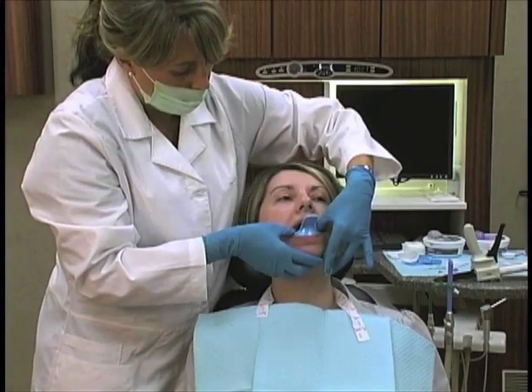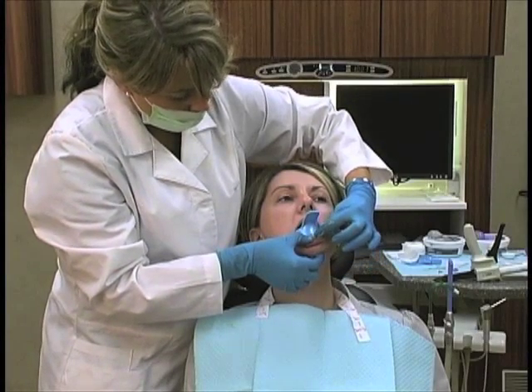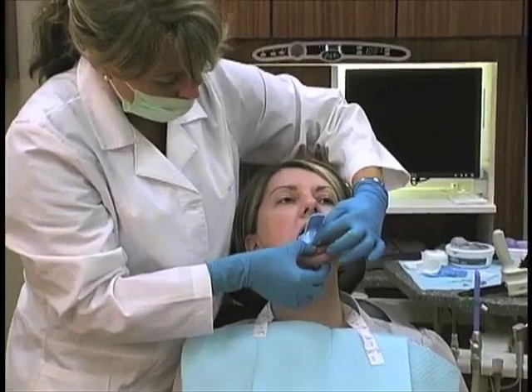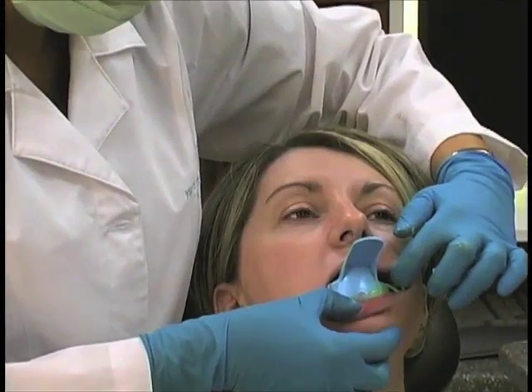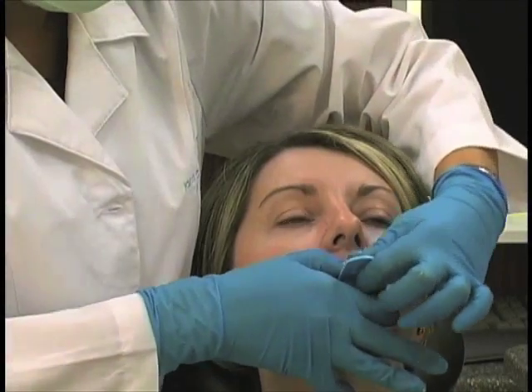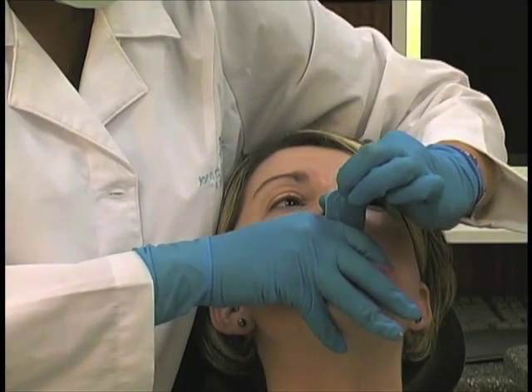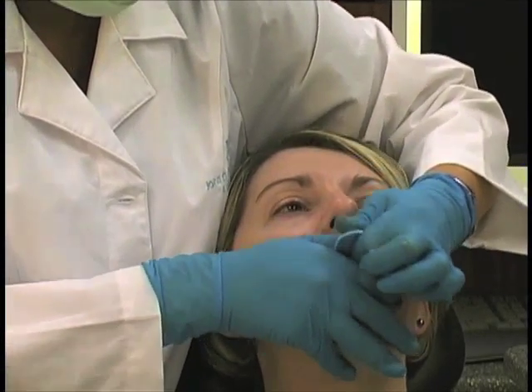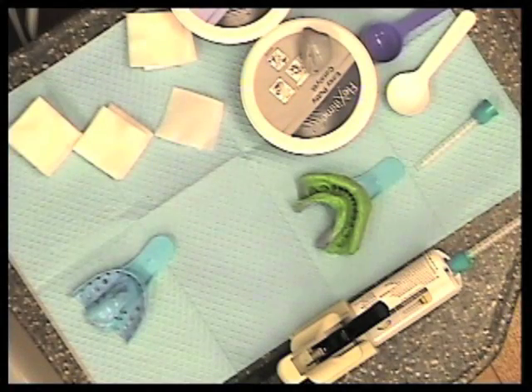Okay, what we're going to see with this material is that the wash material actually will set up first. Set time is about 2.5 to 3 minutes. We really recommend that you do it by feel, because temperature of the operatories is going to affect that. But use your thumb and feel it when it's nice and firm. Then you can remove it with a nice little yank.